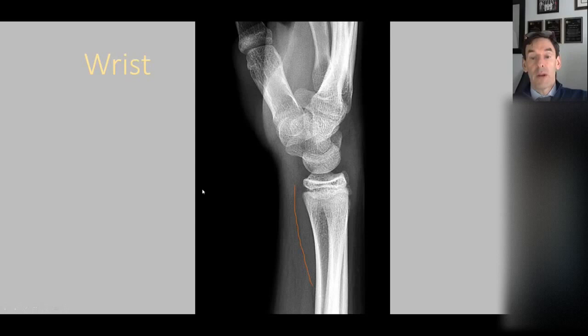In the wrist, there's another fat pad. On the lateral view of the wrist, the pronator quadratus fat pad — which lies superficial to the pronator quadratus muscle — is a fat line visible on the image. In the setting of trauma, it can be obliterated, and in the setting of an effusion, sometimes it's displaced. This distance should be no more than eight or nine millimeters, slightly wider in men than women. That displacement is a secondary sign of a joint effusion, though it's somewhat specific but not very sensitive.